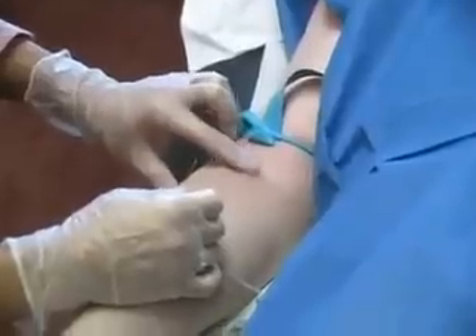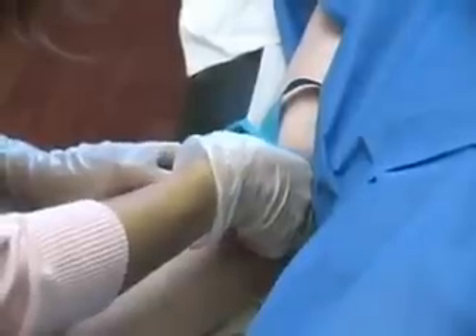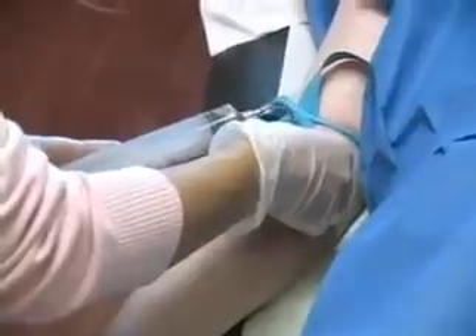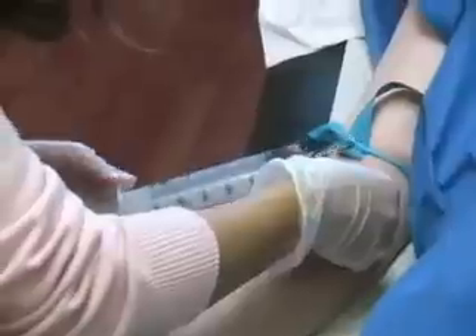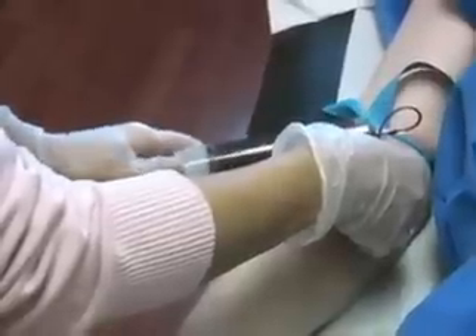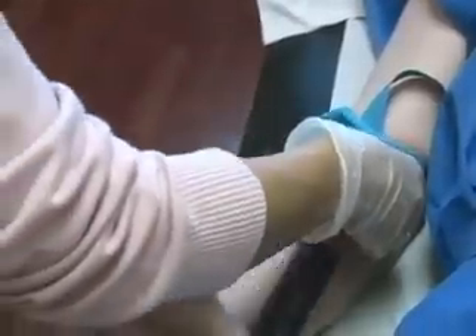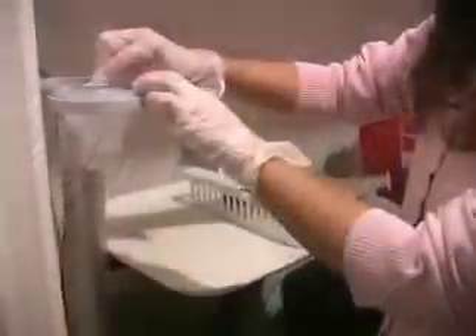Here you're seeing the blood drawn for platelet-rich plasma. When someone has chronic pain, the idea of stimulating the body to repair the painful area — which is the basic premise of prolotherapy — it makes a lot of sense to use as natural a process as you can. Platelet-rich plasma or PRP prolotherapy is a method whereby we concentrate the person's own growth factors and inject those growth factors into the degenerated, injured areas to initiate the healing cascade.